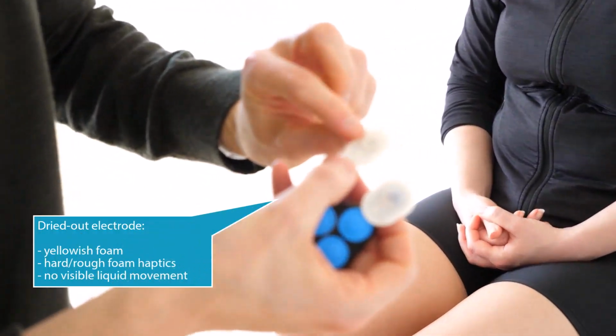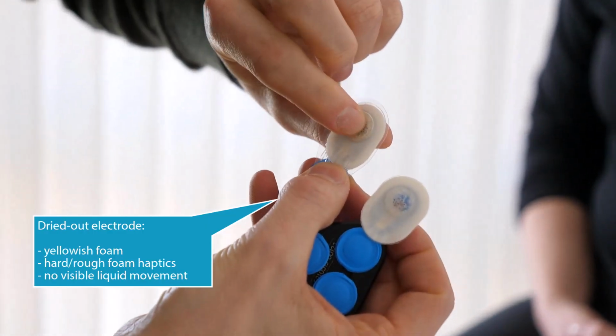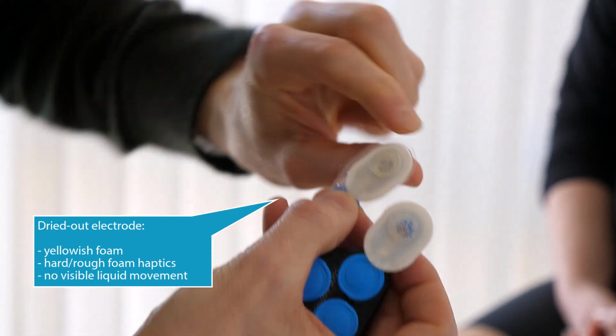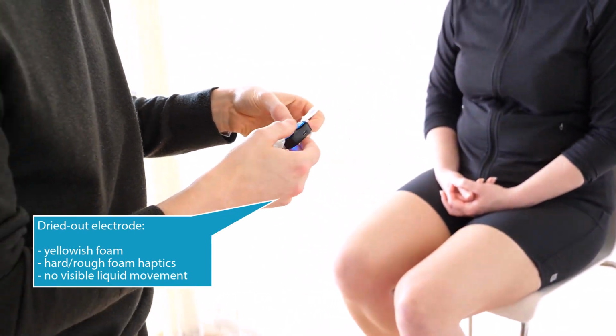With this outdated electrode, I can see that the electrode is dried out and no liquid can be moved under the foil. This is an extreme case. The electrode should not look like this.